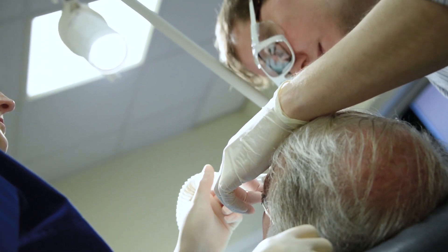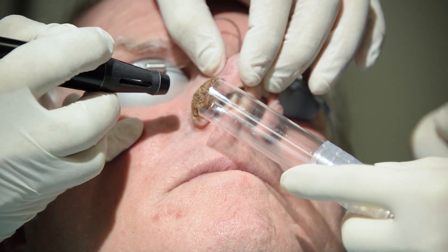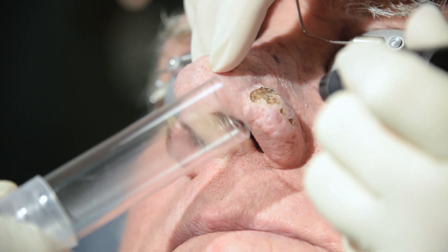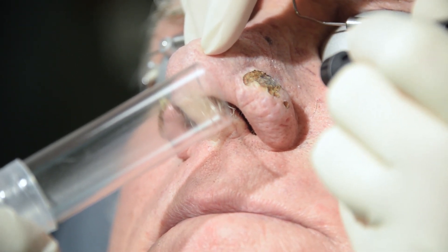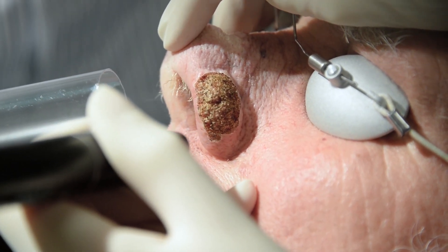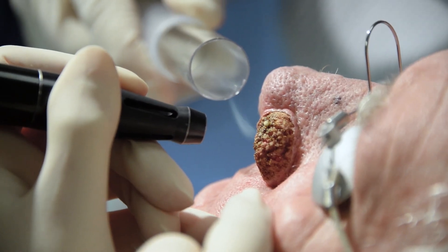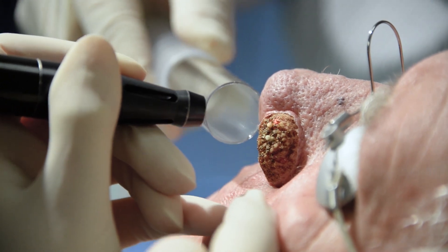This may start at 12 to 18 watts, dependent on the size of the area to be reduced. A layer-by-layer technique is used. The high settings ensure vaporization of the tissue, and there is no requirement to wipe away eschar. Early signs of adequate ablation include visible expression of the contents of the dilated glands, coined the gopher sign by the senior author.